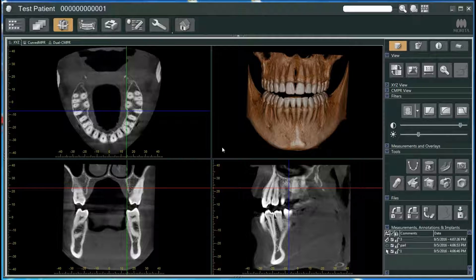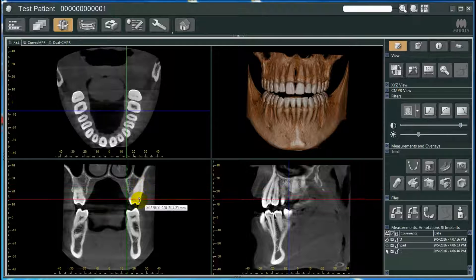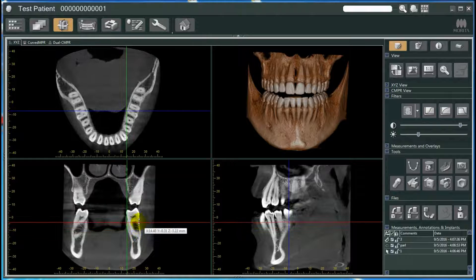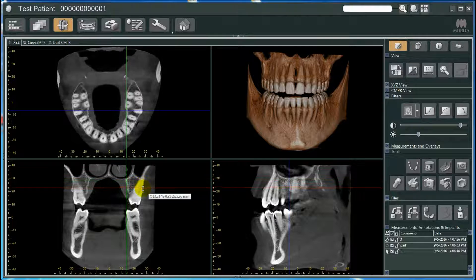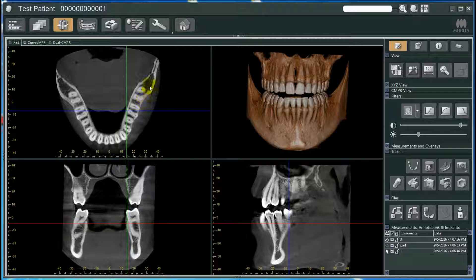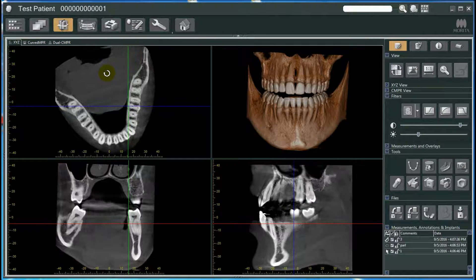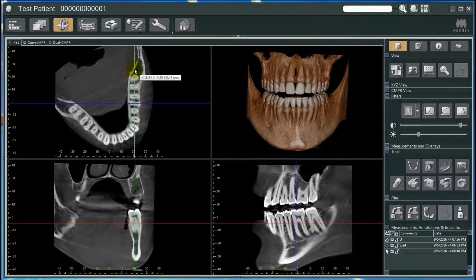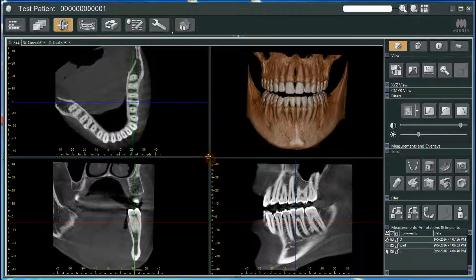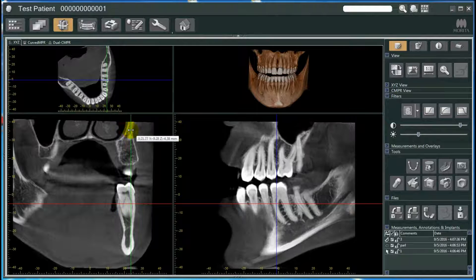One of the unique features I really love about this software is the ability to manipulate these images any way you want — cut obliquely or get any type of view you want. When I'm looking through an image I'll go through the axial slice quickly, looking at symmetry, making sure I'm not seeing anything different on either side, checking for any obvious periapical radiolucency. Then I'll go down to the mandible. I click and drag to turn this view any way I want, and I like to line up my sagittal crosscut with the length of the mandible.